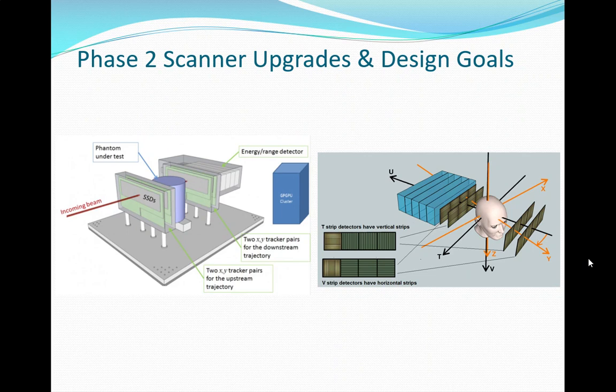So we get 2 on the front, X and Y, and on the back 2. It's traveling through air. There is some energy loss. There is some minor deflection in air, but it's really tiny in the range we're considering. It is way below the uncertainty, so we're not worried about it. So essentially we count that it's going in a straight line until it hits the object. Not technically true, but so close that everything else is lost. Right? So from this, 2 points gives you a line. That's how we figure out the entry line. Same thing on the back.